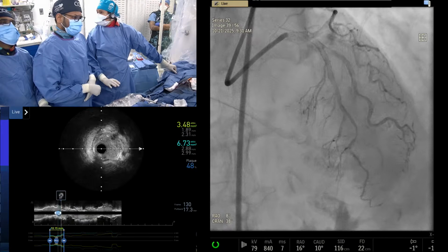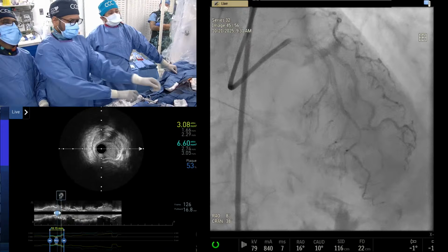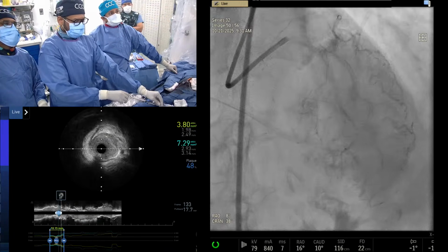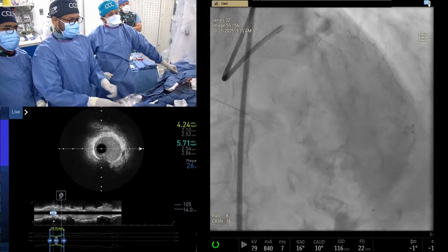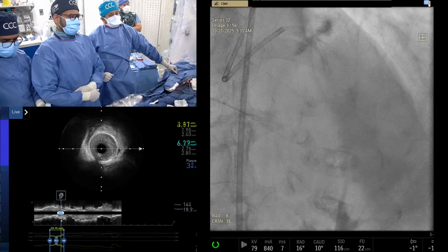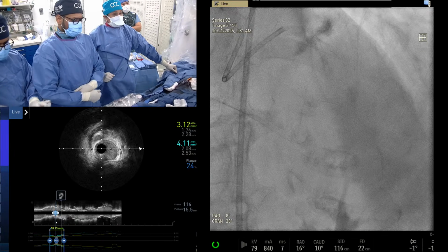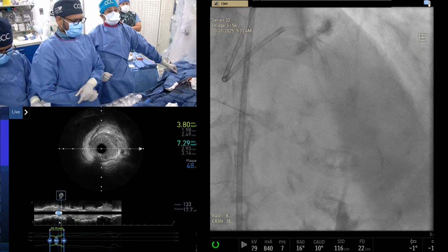Yeah, we know that. But that was the thing, remember? No, the issue was, remember I kept saying we need to go forward because I was worried we never covered it. But I think we can leave it now because we are reaching a level where everything is getting very complicated. Every bridge, movement of every balloon, every wire was very difficult.